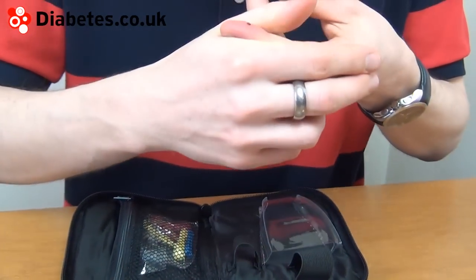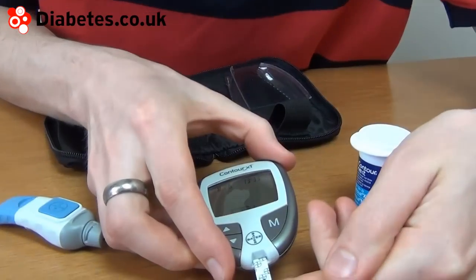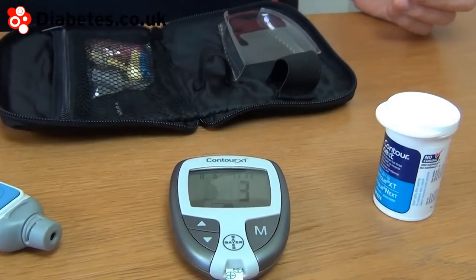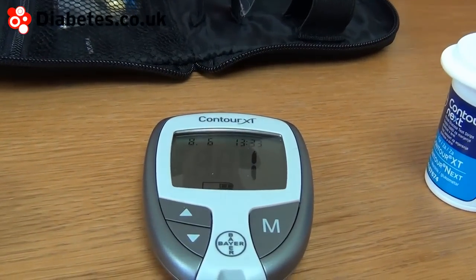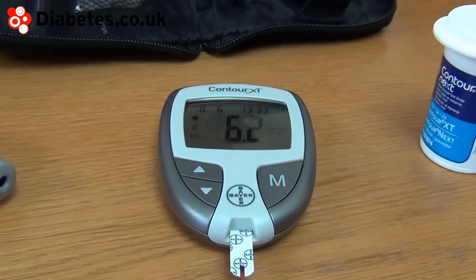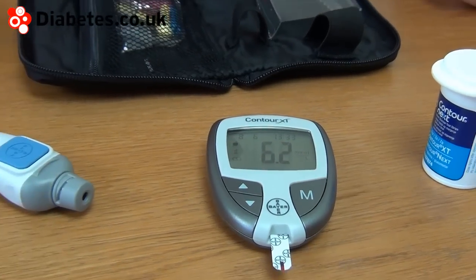If we can draw a good drop of blood, within a few seconds we shall have a result. So that's a 6.2 — I'm happy with that.